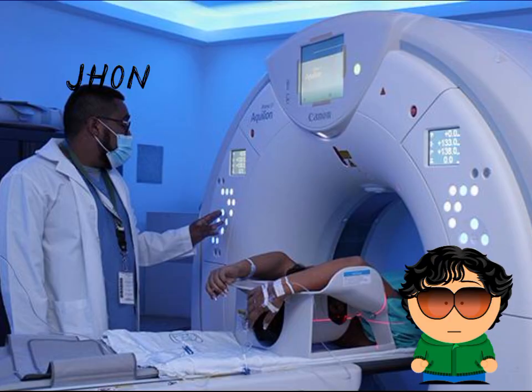Generalities of tomography. Tomography is a medical imaging technique that allows visualization of sections of the human body in different planes. Here is a general medical overview. The word tomography comes from the Greek tomos, cut, and grapho, representation. It refers to obtaining images of body sections, which allows internal structures to be seen without surgery.